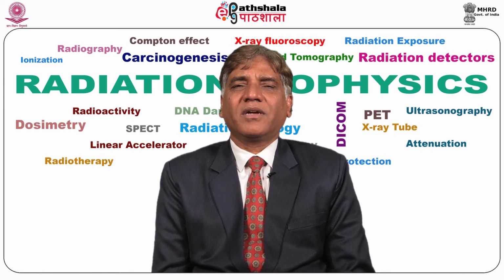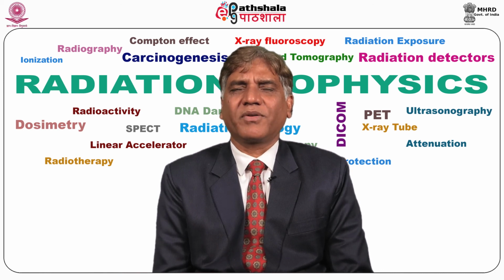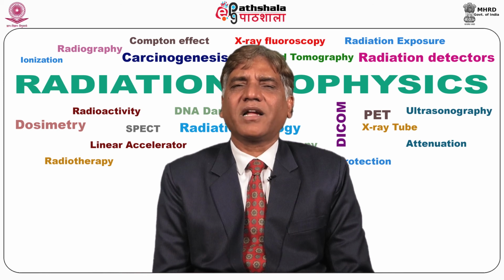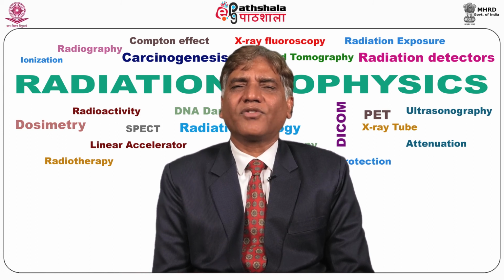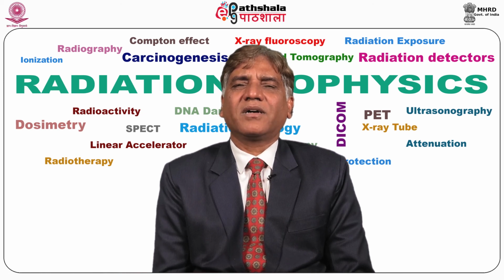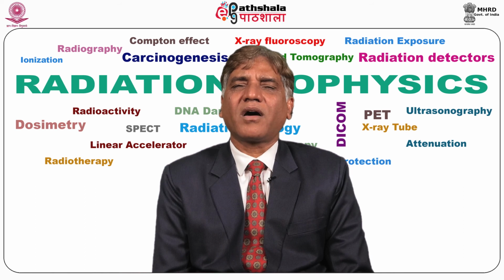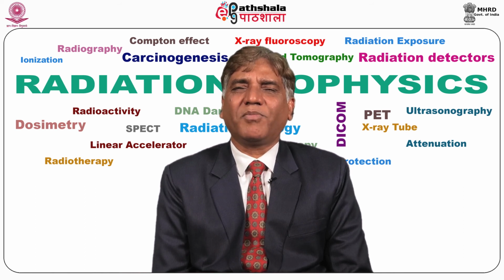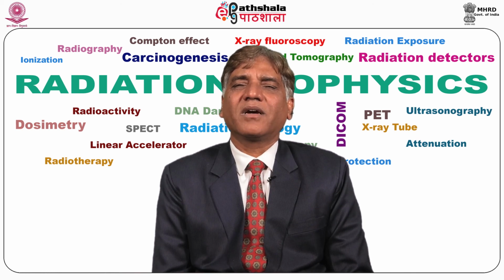The transducer is the device which produces ultrasound waves and detects the ultrasound waves. At first it acts as a transmitter, wherein the electrical pulses are converted into ultrasound pulses, and these ultrasound pulses are sent out into the patient. When ultrasound waves interact with the body tissues, a portion gets reflected in the form of echoes, and these echoes are detected or received by the receiver, which converts these ultrasound pulses into electrical pulses again.